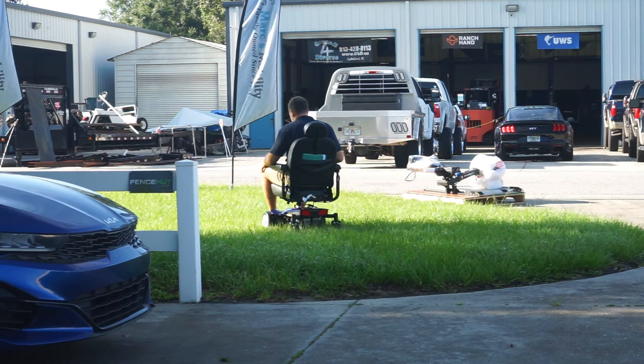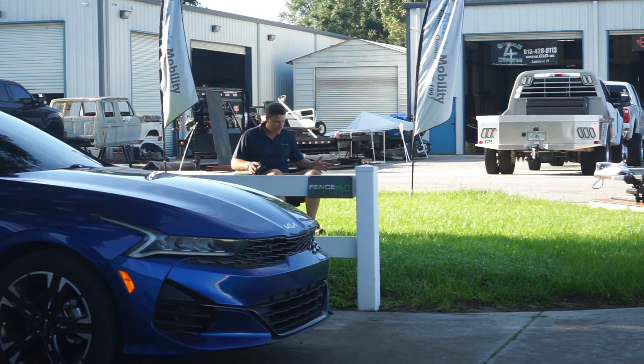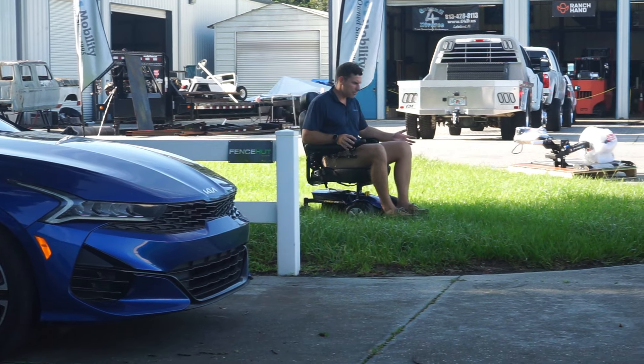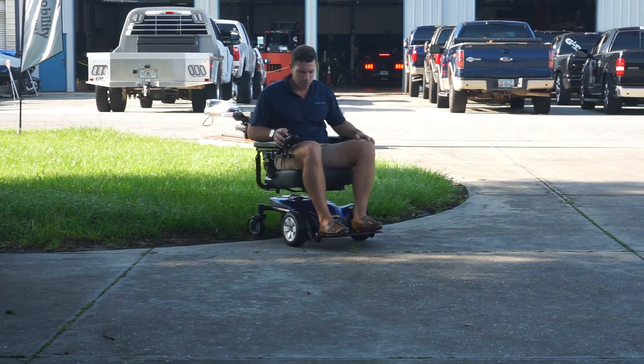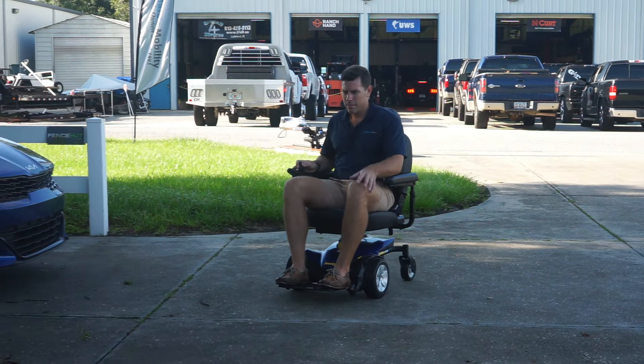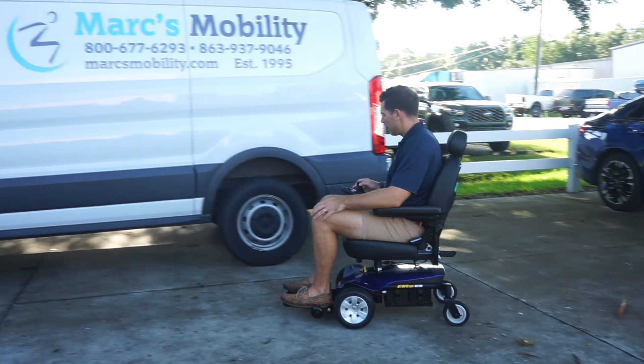It's not an off-road power chair, but if somebody wants to get to their grandkids' baseball or soccer games, you can see it's plenty able to go right through this grass with no problem. Obviously sand or crazy types of terrain — don't even try it — but if it's thick, compact grass, unless it's St. Augustine, I don't think you're going to have any issue with this type of chair.